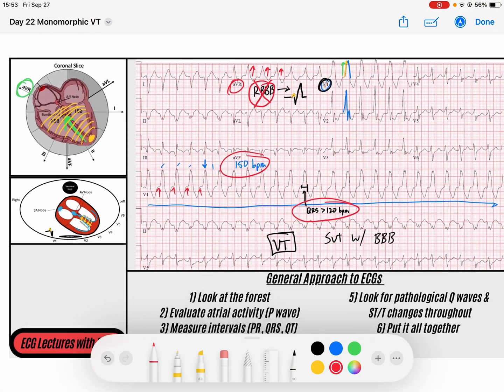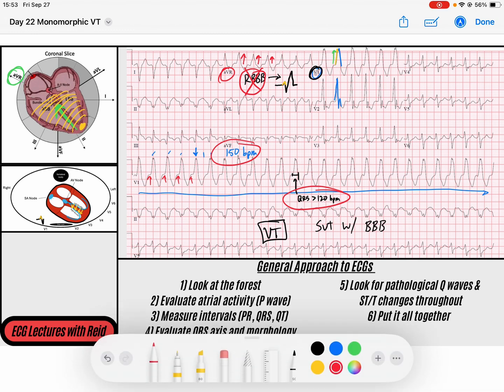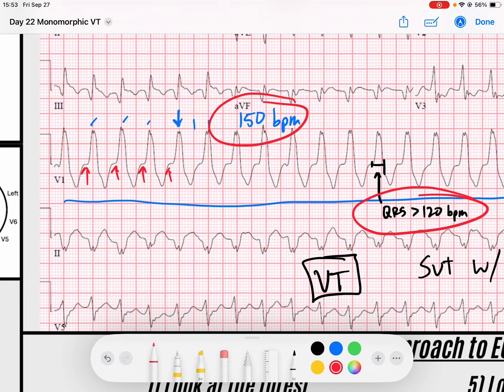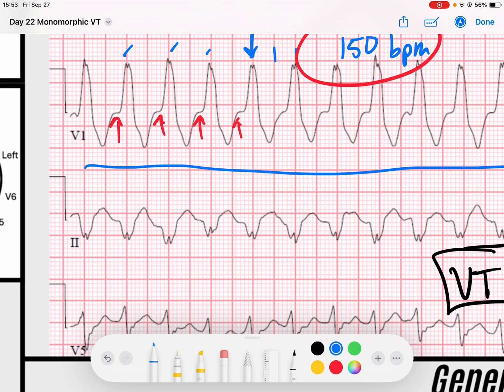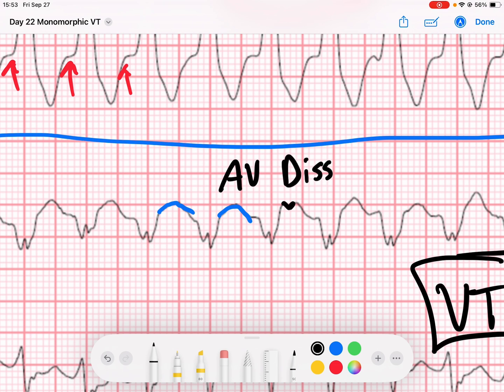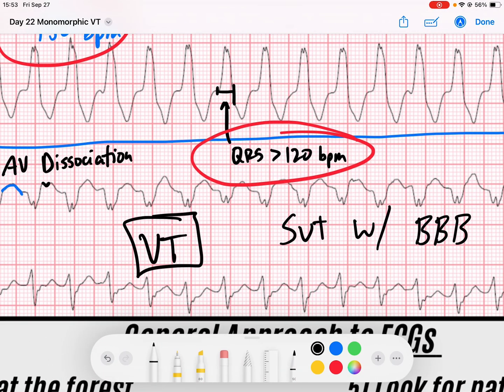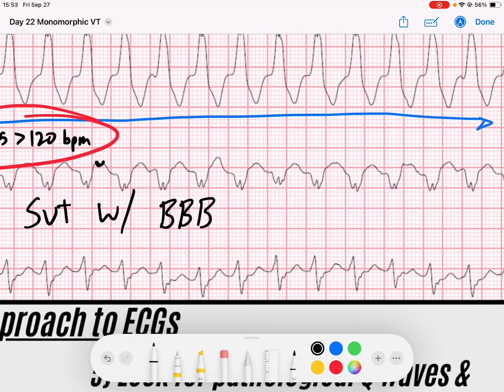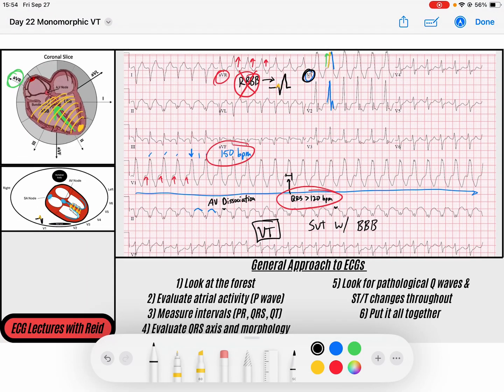I'm going to look very subtly for AV dissociation. Remember, AV dissociation is the hallmark of monomorphic VTAC. When I look closely, I look for bite-sized P waves — bite-sized atrial activity. Look at my normal T waves: they're kind of broad, slopey T waves. But look at this one — there's a little chunk taken out of that T wave. If that little chunk is short and sharp, that is evidence of AV dissociation. Here's another one here — atrial activity occurring sporadically at a rate less than the ventricular rate. That is a good example of AV dissociation.